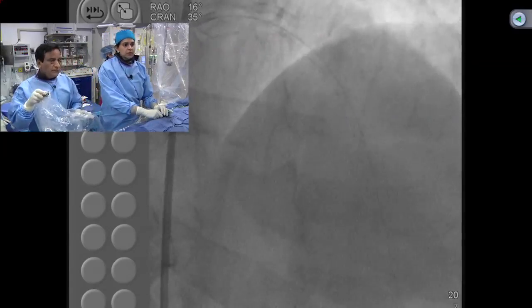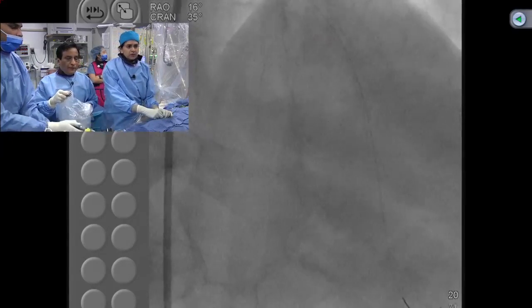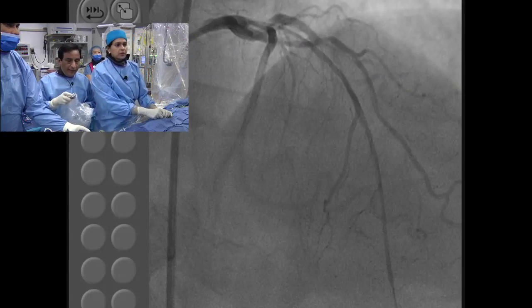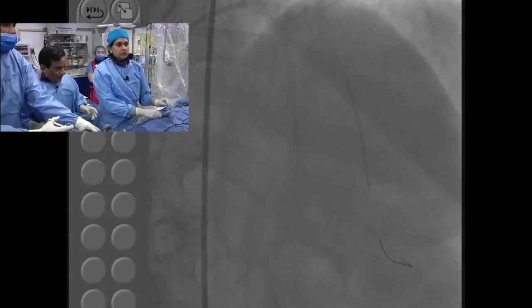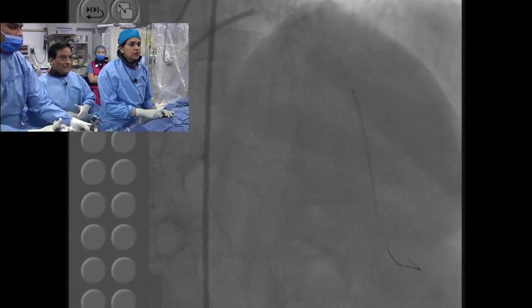Yet with far greater ease of use, no? Absolutely. Clearly this will be for the centers which are not used to using rotational atherectomy. Here, Sinai is a little different. If we don't do a rota, nurses and fellows ask me why we are not doing rota. But compared to other centers, it's a big deal. Go.